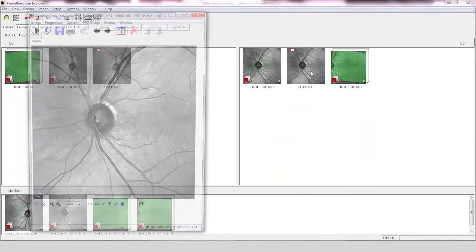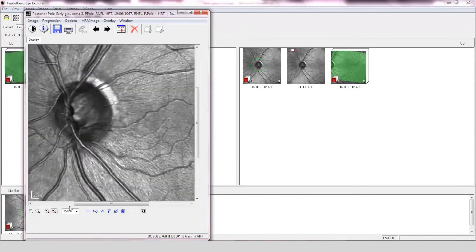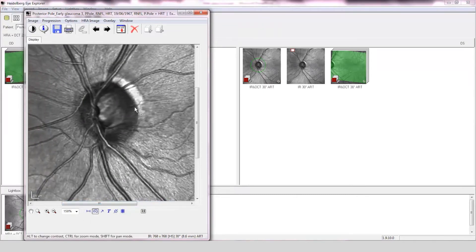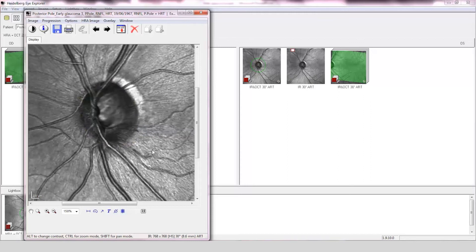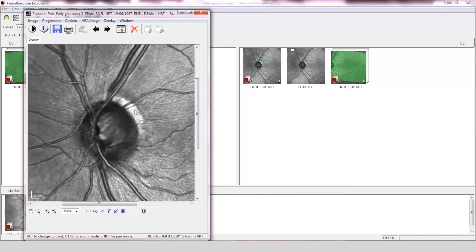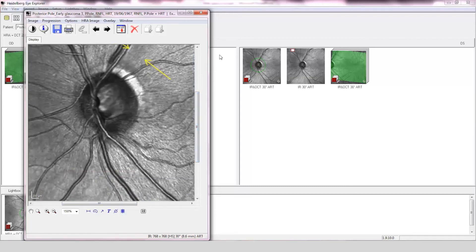Optic nerve assessment of the left eye. The disc is small in size, approximately 1.9 mm in area. The cup-to-disc ratio is approximately 0.5 and the disc conforms to the ISN'T rule, although there may be a superior notch present. The striated pattern of the retinal nerve fiber layer is absent in the temporal superior quadrant. The reflectivity in the infratemporal quadrant appears normal.